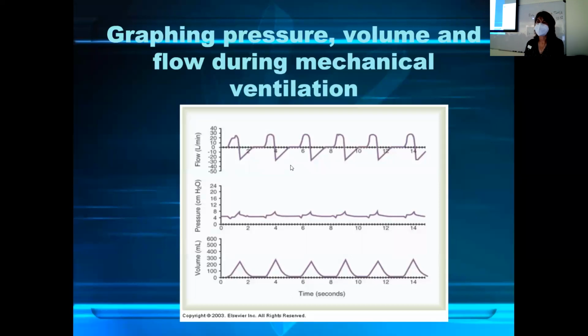Question? Yes, ma'am. The first level where it reaches about 25, there's like an indentation, and then it goes up. What happened there? So they were breathing in and maybe hiccuped or something. Like the flow stops and then it continues. So maybe just like a little pause in their breath.